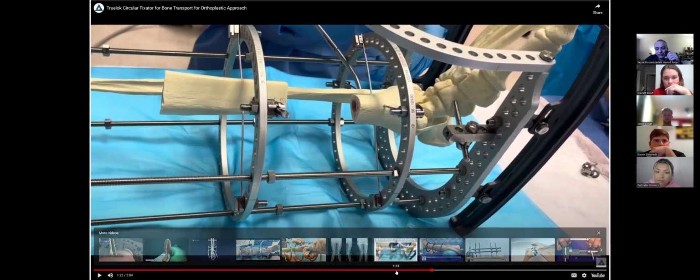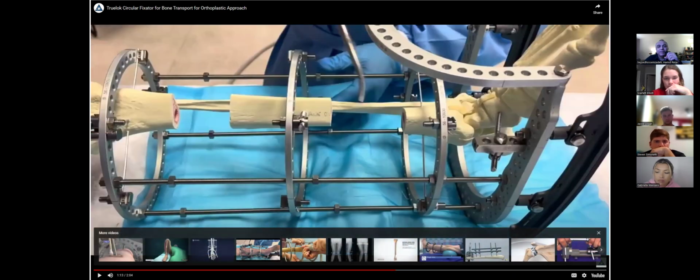But I want to show you something. For example, one problem here. You see, as the bone is transported downward and distally, this part will continue to move along the orientation of this body. And if it continues to move, it arrives here, and there will be a step, you see, a mismatch here, because the alignment of the bones is a little bit different.